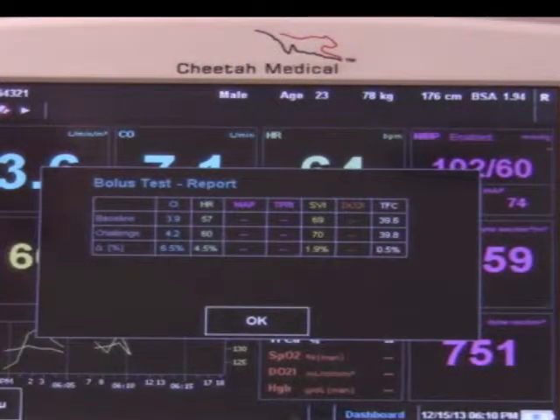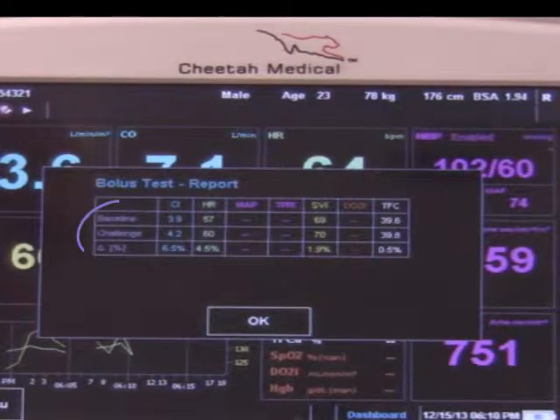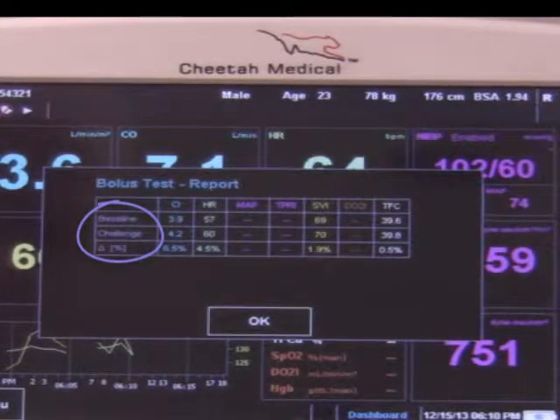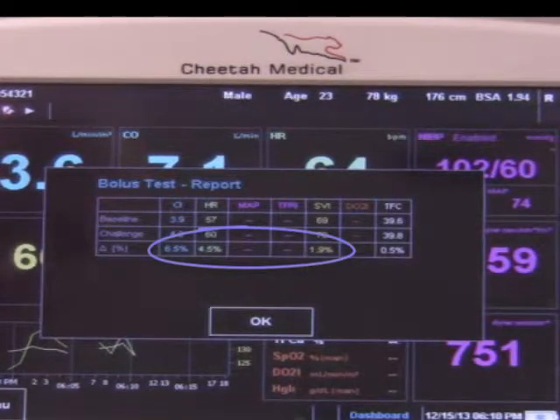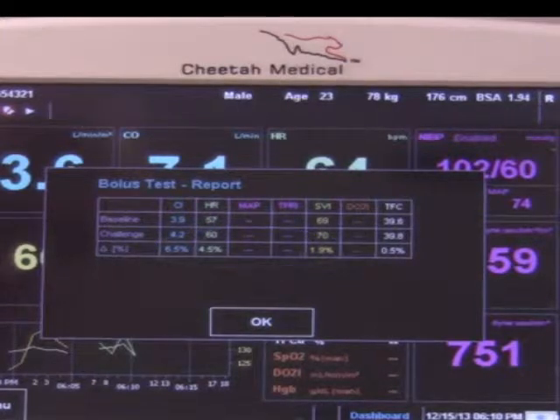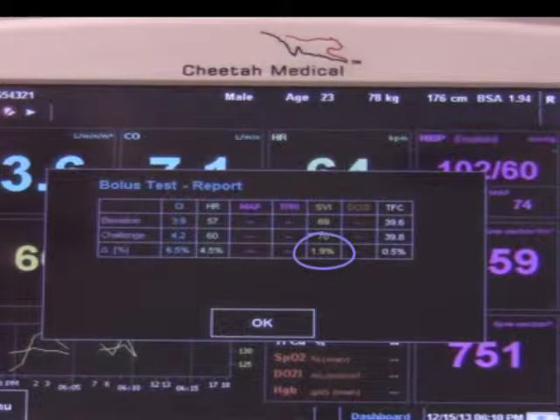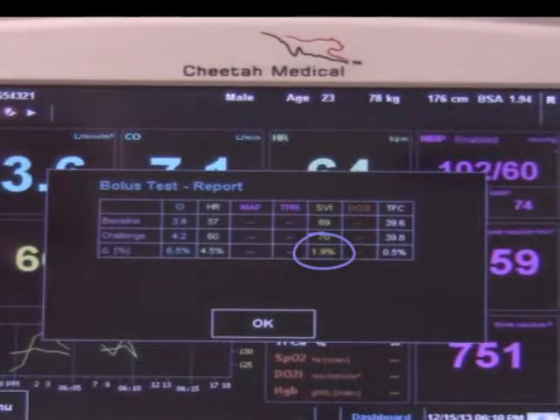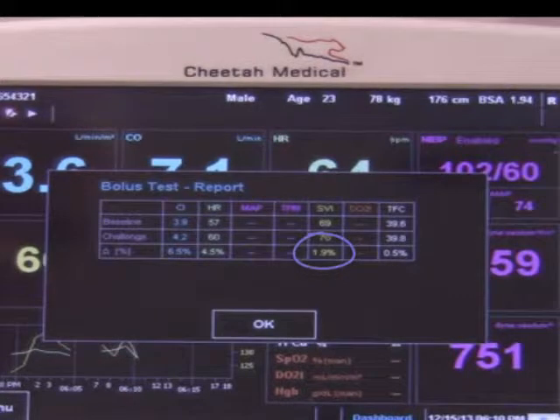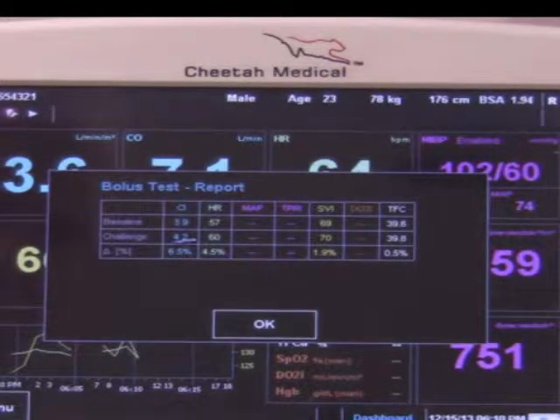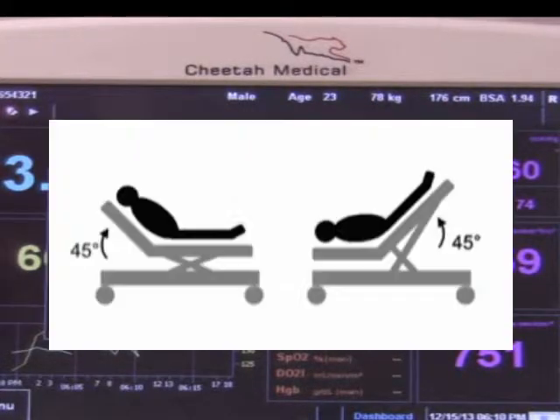The bolus test report is displayed when the test is completed. The table rows indicate the baseline, challenge, and percent change in the cardiac index, heart rate, and stroke volume index. An increase of more than 10% in the stroke volume index is considered significant and suggests that the intervention was beneficial. In this patient, the SVI was essentially unchanged following the intervention. There is an insignificant increase in the cardiac index related to a slight increase in heart rate during the test period.